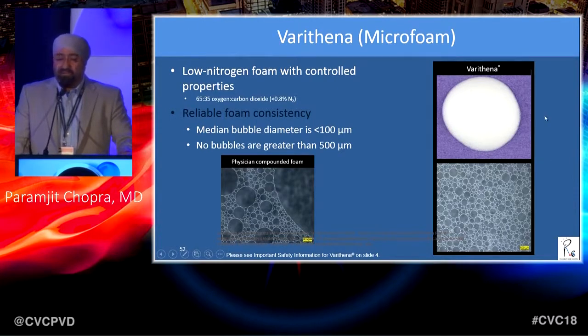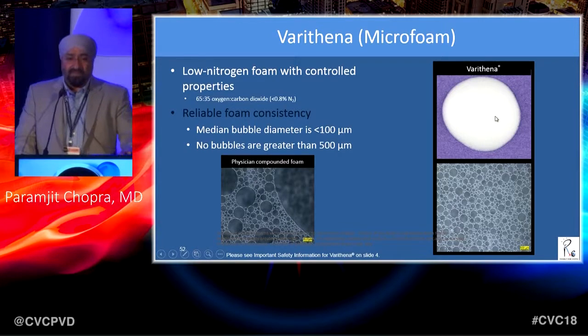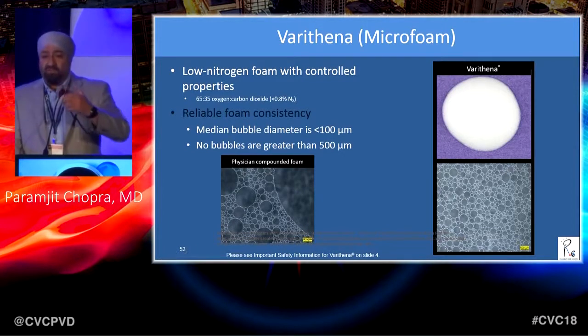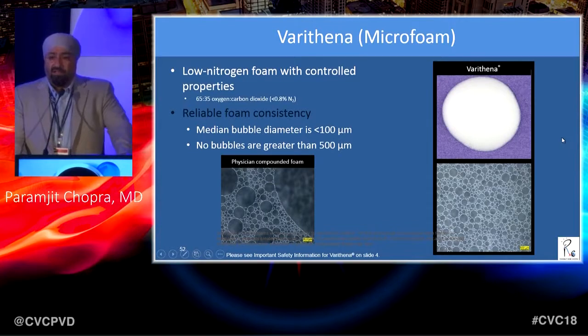I agree that if you're very, very diligent in making the foam, and you're doing it well, yes, you can get that. And if you're doing that, you want to make less is more. But to me, the safety of Varithena just outweighs all of this. So now even CEAP 1 and 2, I mean, we have cans lying around and I have enough. And when I do saphenous and other branches, I let it go all into the other reticular branches. So it's a kind of bonus for the patient. They love the fact that they've had a good cosmetic appearance as well, and it works out.